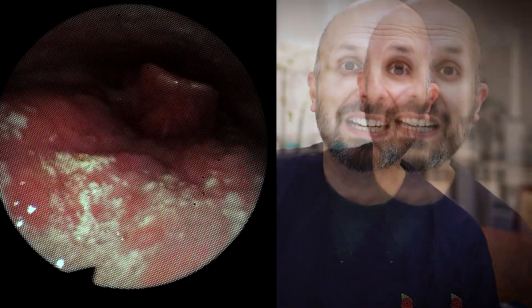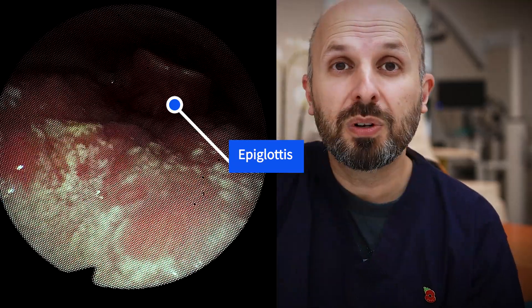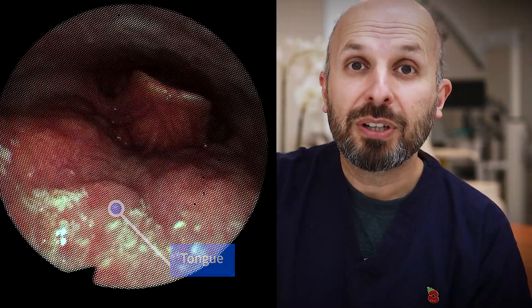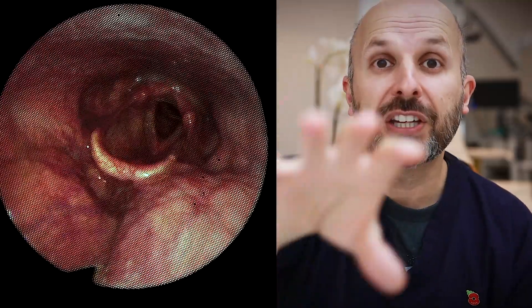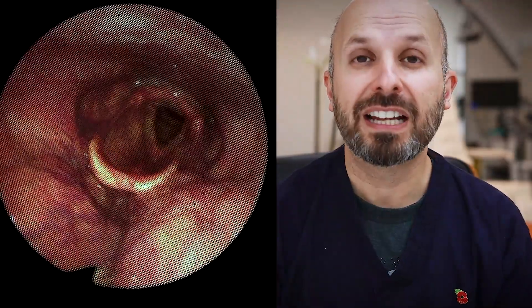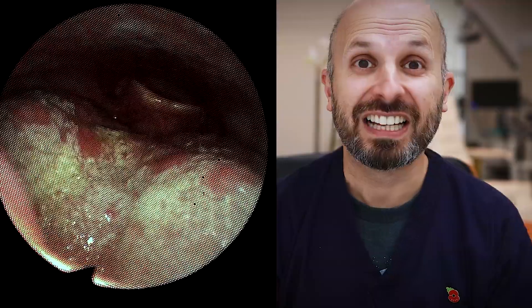He's awake at this time and we just wanted to see the timing. If you look at this video, you'll see the voice box or the epiglottis at the back and the back wall of the throat. The tongue is down here — I'm looking in from the nose, looking down into the throat. Now we turn on the Inspire implant and you'll see that one side of his tongue brings the whole tongue forward, as well as the epiglottis opening up the airway. You should be able to see the voice box now, the little vocal cords, and there's a much clearer airway. A really nice view of the inside of his throat — it's amazing to see how well he did.